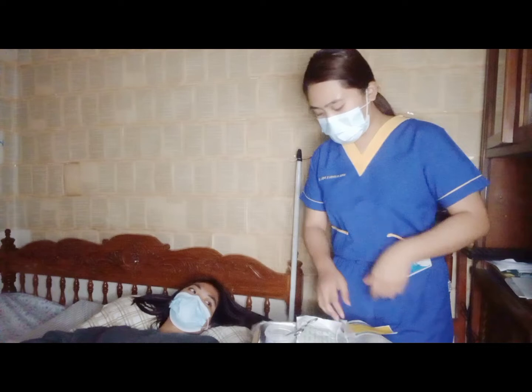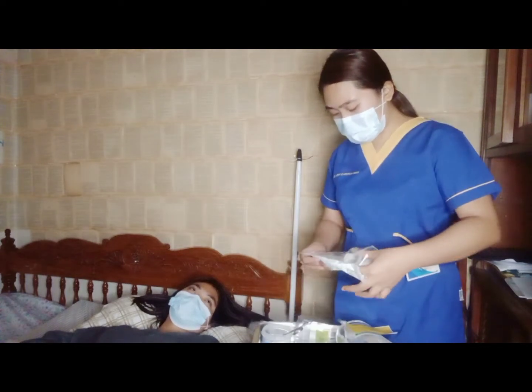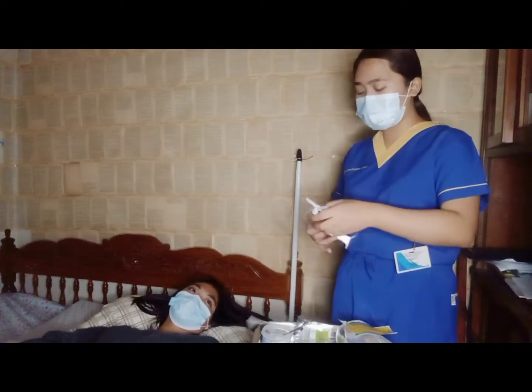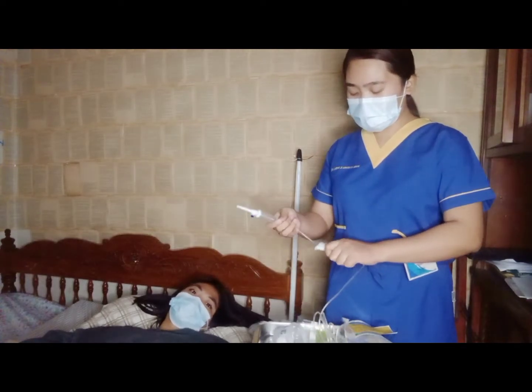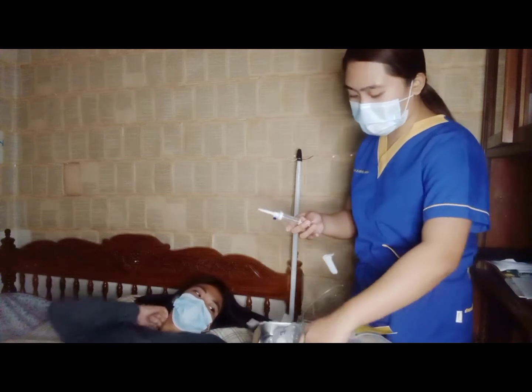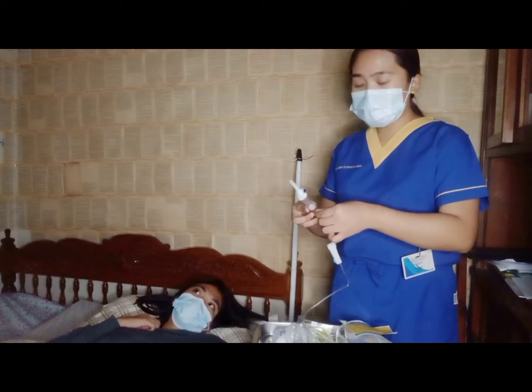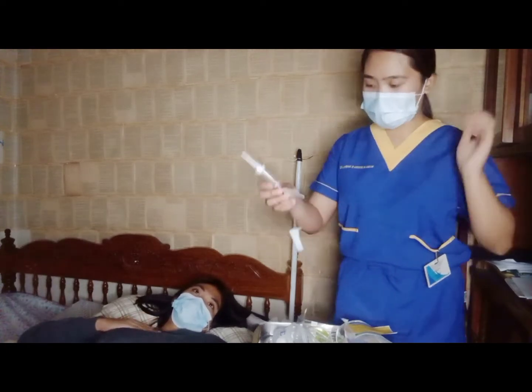Then, we will open the administration set using aseptic technique to prevent contamination. And then, we will close the clamp. Then, we will put on a label. This label will indicate when the IV or administration set will be changed.